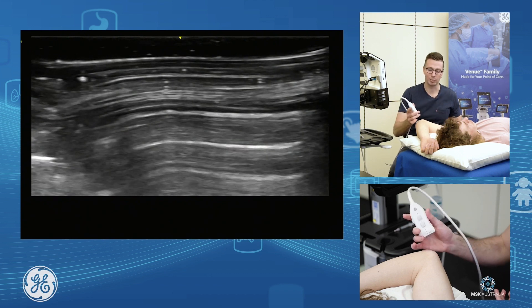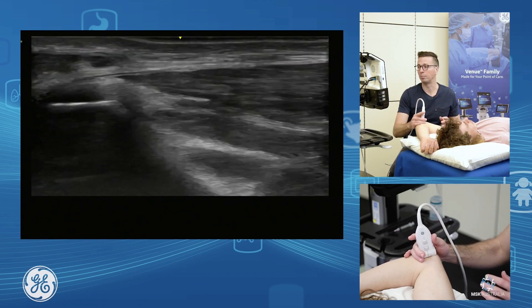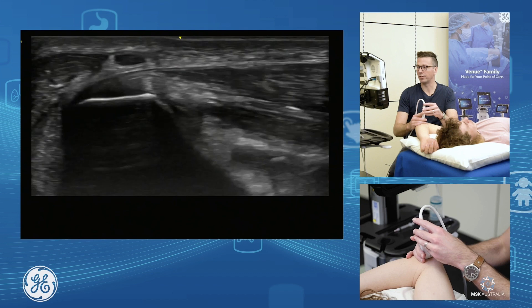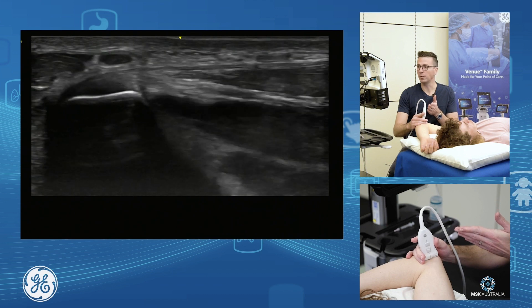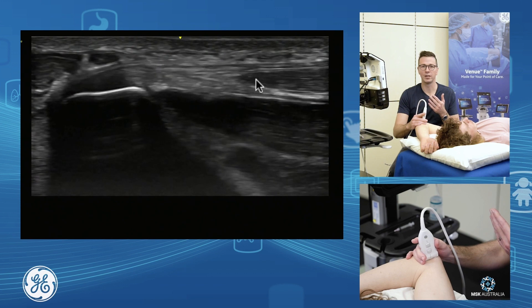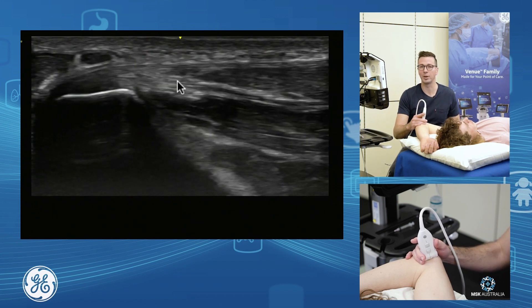If we have a look at our common flexor tendon, I pretty much just palpate the medial epicondyle and pop my probe right down on top. Once I sit on top I grab my bony facet anatomy and I angle my probe towards the patient's thumb, which gets me truly more on the common flexor tendon — I can see the musculotendinous junction quite nicely.